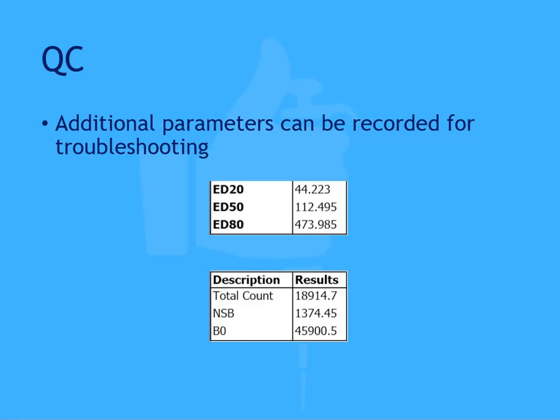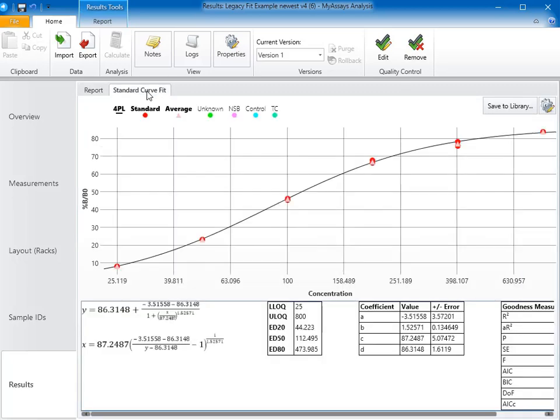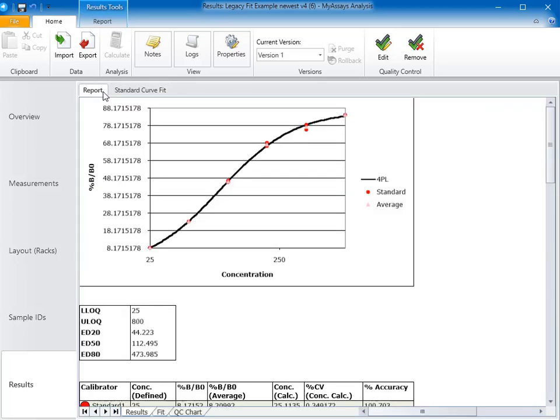I have an example RIA protocol with data already calculated. In order to determine assay validity, first I'll view the curve. It looks like a good fit to me. We can click on the standard curve fit tab in order to view the fit in an interactive chart. Back on the report tab, we can see some of our other parameters.